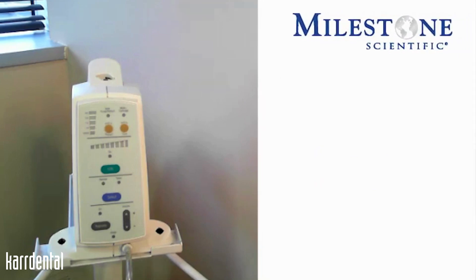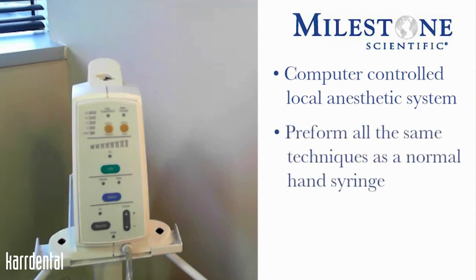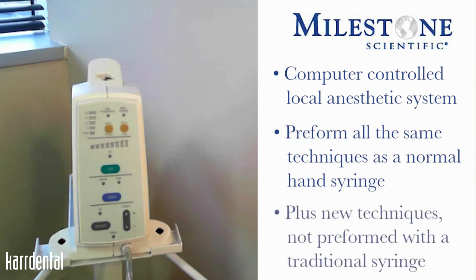The STA single tooth anesthesia system is a computer controlled local anesthesia delivery system that will do all of the same traditional injection techniques that you're currently doing, but now allows you to do some advanced injection techniques that are not routinely being done with the traditional syringe.